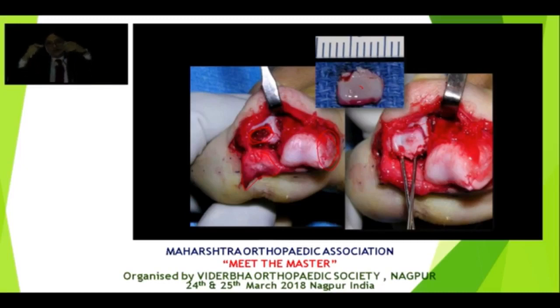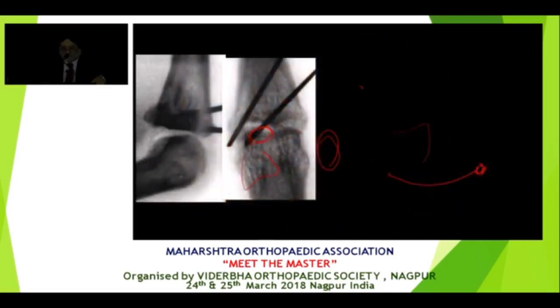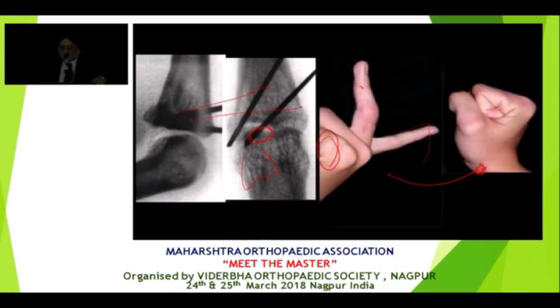But what happens with these small fragments is when you reduce it, the articular pressure holds the piece back. It's like when we put that lunate piece back. You put it back in and you reduce the joint, it catches it. So once we put that in, we then put a bone anchor here and repaired that collateral ligament back here, and that restored stability to the joint. So then we left those K-wires coming out the back of the finger for 3 weeks. He was able to move through a limited range for the first 3 weeks. Then we took out the K-wires, and he got back pretty good range of motion. So there's my incision on that side.